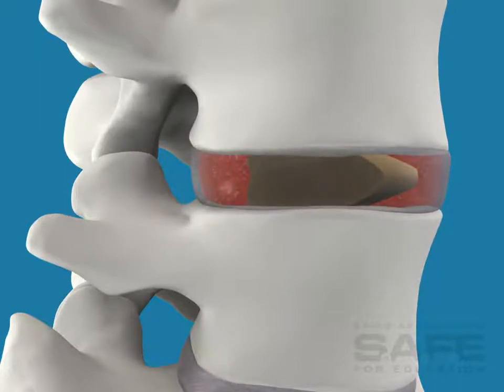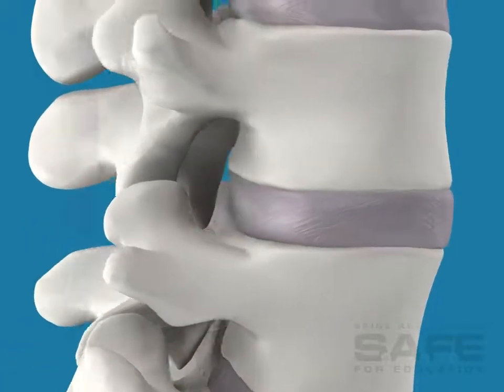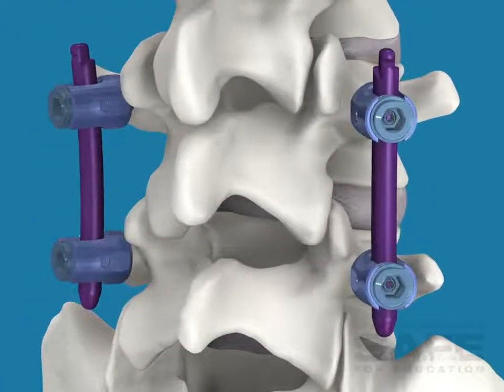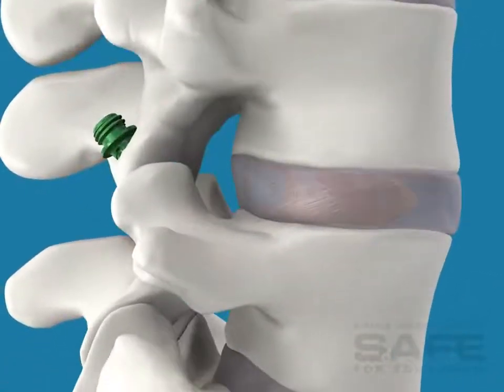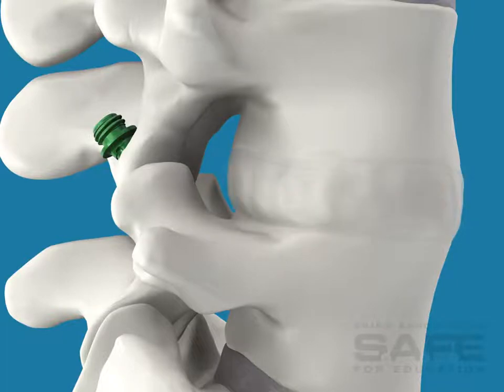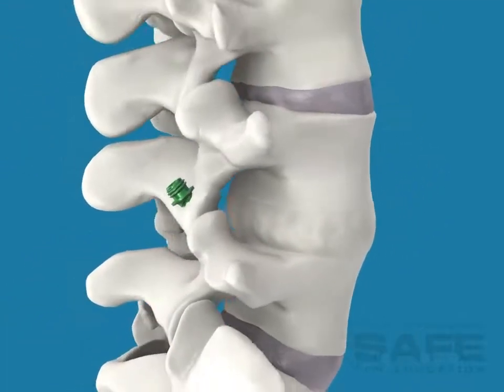The implant maintains the spacing of the vertebrae while the fusion takes place. This procedure is normally accompanied by a posterior fixation with pedicle or facet screws. After the fusion is complete and a solid bone mass forms, the two vertebrae are joined together. The OLIF is frequently performed as an outpatient procedure.